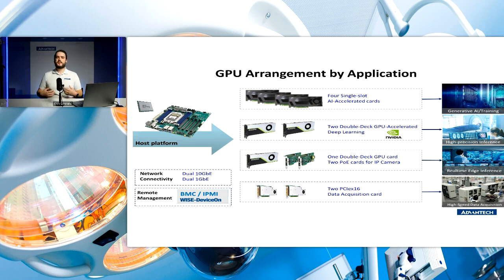Beyond that, for high precision inferencing applications, you might actually see this more in MRI applications or X-ray, or anywhere where you're working with really large images that are often raw data. You might do some inferencing operations. So you'll take some of that imaging in, and cross-reference it with some known images of what an anomaly might look like, and you can use that to help the doctor, or the radiology technician, achieve results in a faster or more precise manner.